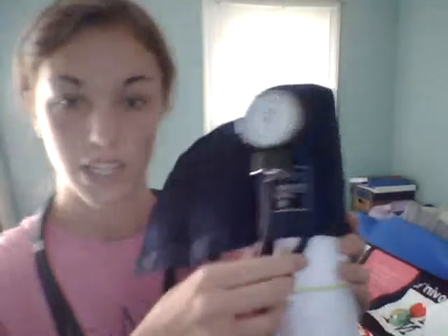The two readings are going to be measured in millimeters of mercury on this blood pressure cuff here. When you're applying a blood pressure cuff, you want to make sure that the arrow on the cuff follows the line of your artery — the brachial artery right in the middle of your arm. I've drawn the artery right here on our arm and it's this pink line here. So as you can see, the arrow is about two inches from this line, indicating the fold in your elbow.